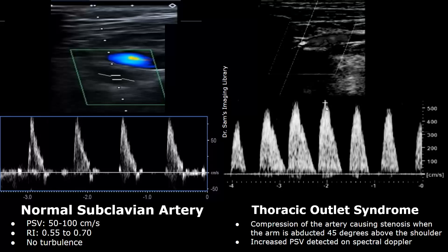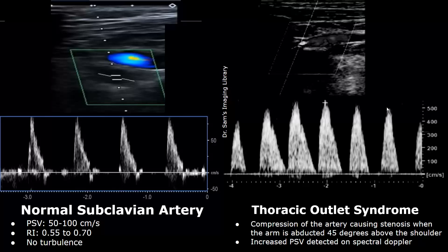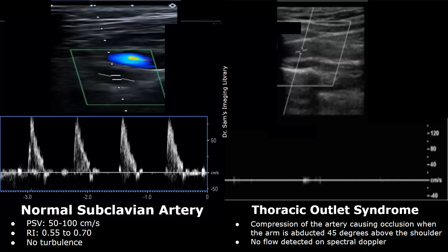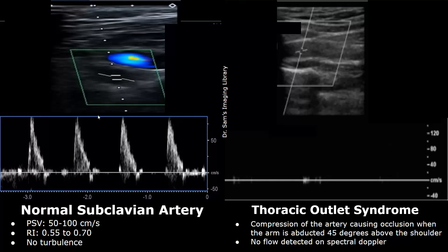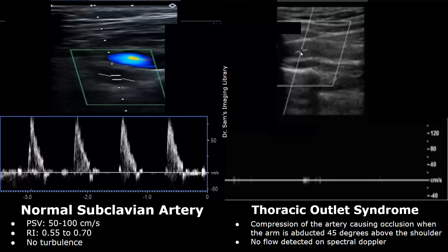The artery may be compressed by a nearby muscle or in patients that have an extra rib. When the arm is abducted above the shoulder, we have very high velocities — above 500 centimeters per second. Here is another case of thoracic outlet syndrome. When the patient is at rest and the arm is in its normal position, the waveform will be normal. But when the arm is abducted 45 degrees above the shoulder, no flow is detected on spectral Doppler. The artery is completely compressed and shows occlusion.